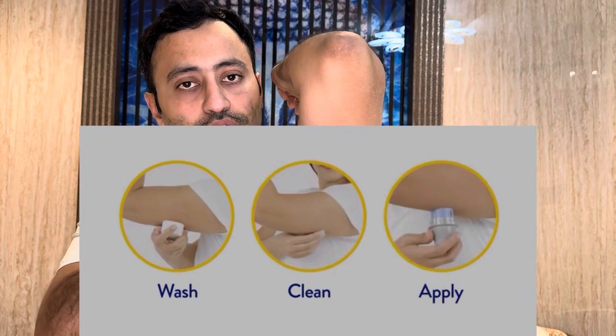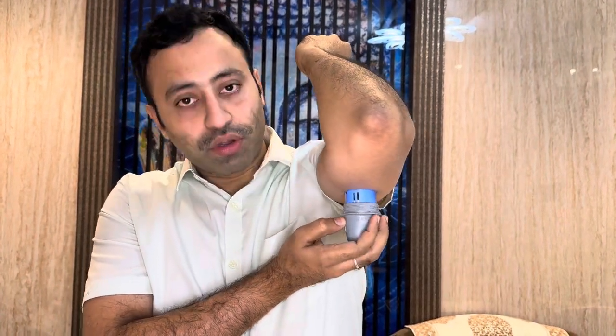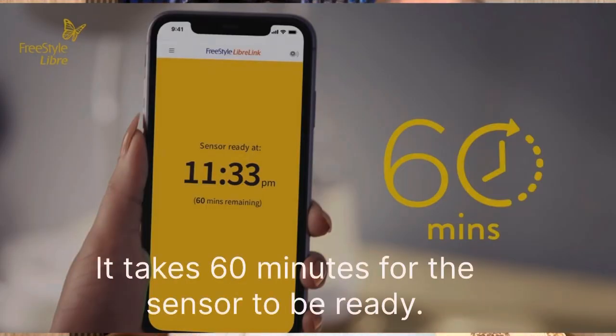The needle is here and we're going to apply the sensor to the arm — make sure the surface is clean and free of hair so it sticks properly for 14 days. Like this, you apply it and that's it — it's not that painful. You can feel a pricking sensation as the needle goes in, and the sensor has been placed. That's how you do the application.